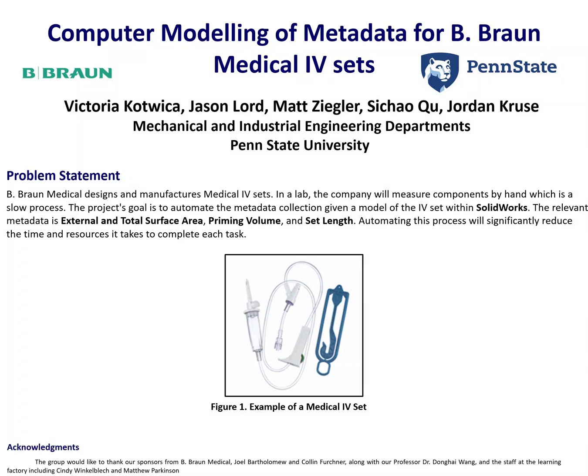Hi everyone, I'm Jason Lord, member of the Braun Medical Capstone group, where we've been looking at IV sets this semester as a part of a group from the Mechanical and Industrial Engineering departments at Penn State University. The problem we've been faced with is Braun is trying to convert physical measurement processes into virtual environments using SolidWorks. And these measurements we're looking at are priming volume, surface areas, and set length.